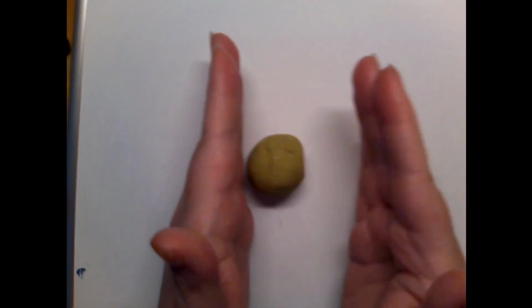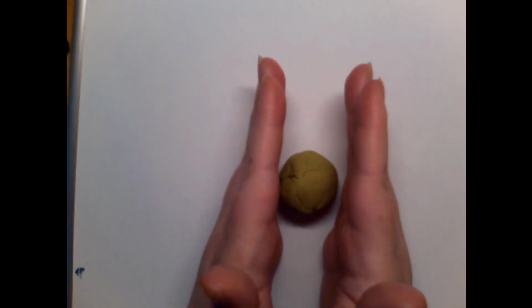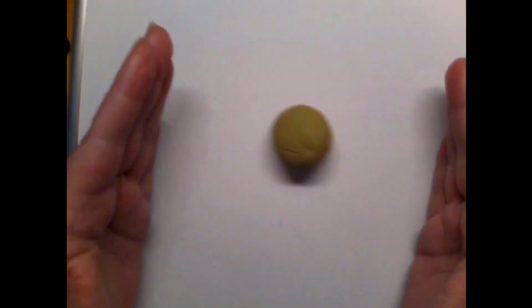What if I increase my depth? Now my hands are further away. To get this pulse all the way down to this other hand and send it back takes a lot more time. So now I'm increasing the amount of time that this hand is waiting for that ball to come back. So again, remember, close, boop, boop, boop, boop. Those go really quick. That's a decreased depth. That's very shallow imaging. Depth and transducer really far apart, that's going to be deep imaging.